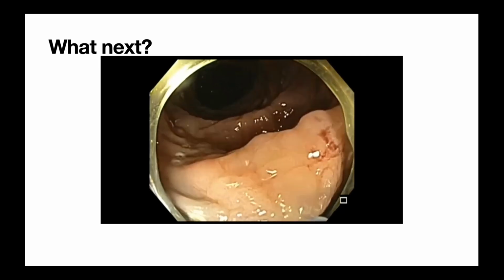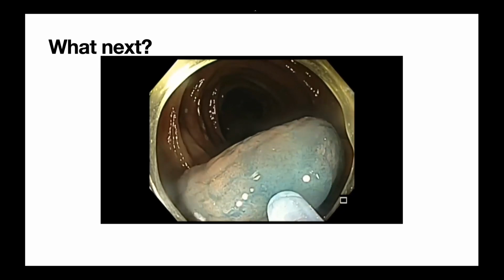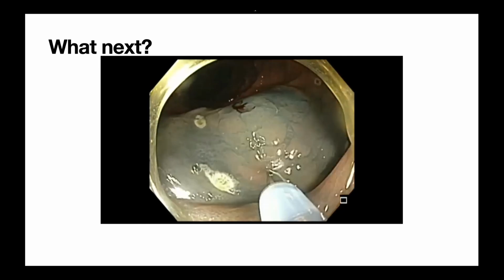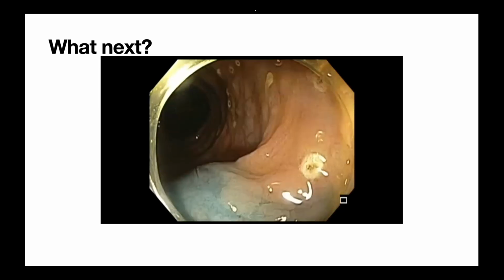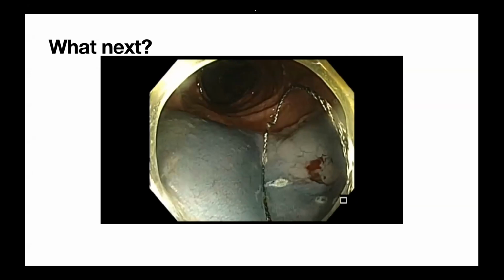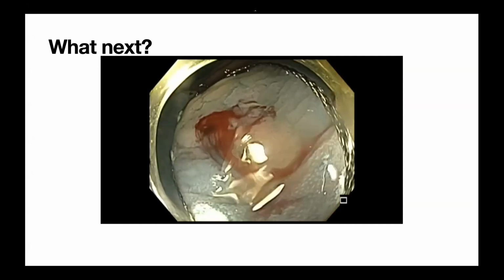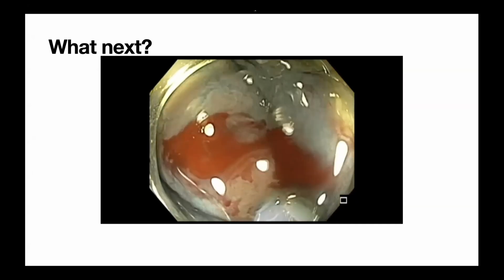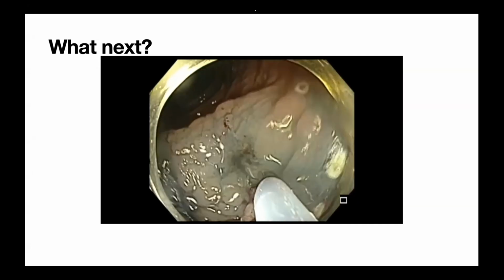Because I agree with Roy that the image which you first shared looked very much like an SSA with ill-defined borders, cloud-like appearance. Maybe because it's multiple polyps resected piecemeal, and since they were all close together, there's a possibility that the samples might be mixed up. So this one is an SSA. You see, because it turns white after you inject. It has so many signs here.